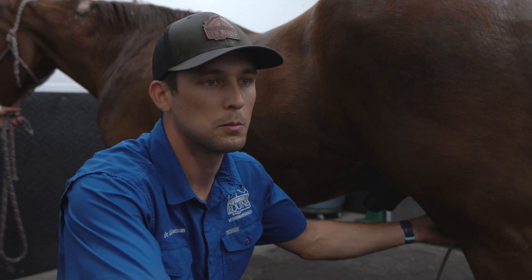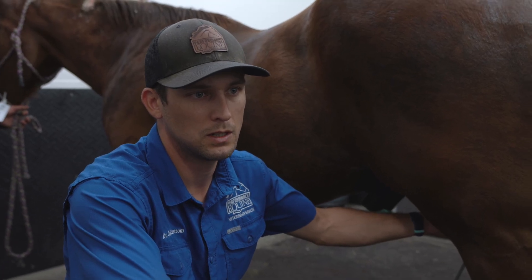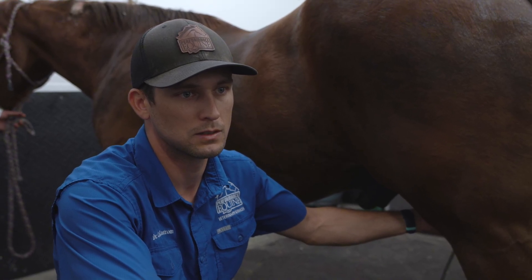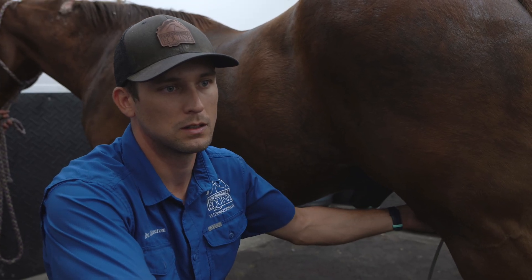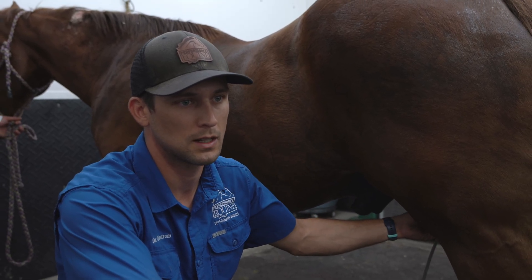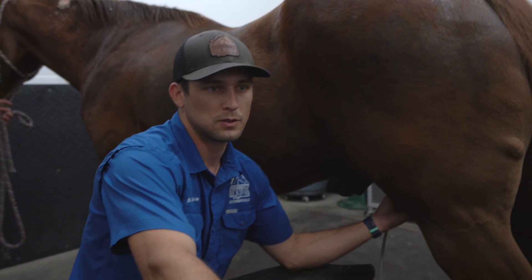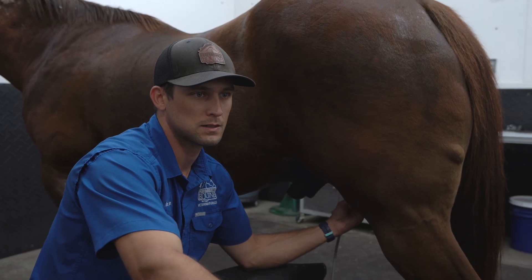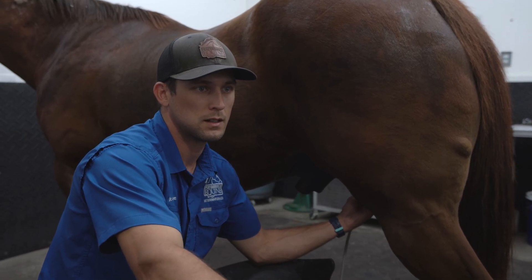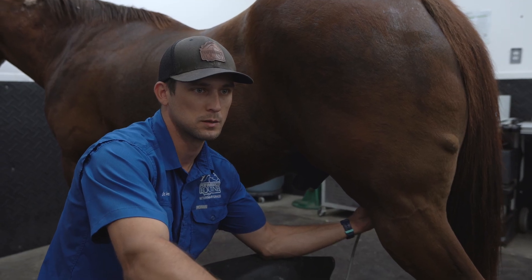Right now we're doing an ultrasound of the medial compartment of the stifle, called the medial femurotibial joint. Looking at the medial meniscus, medial collateral ligament, medial femurotibial joint capsule — looking for signs of injury, inflammation, arthritis, any cause of pain that would result in the lameness we're seeing on him.